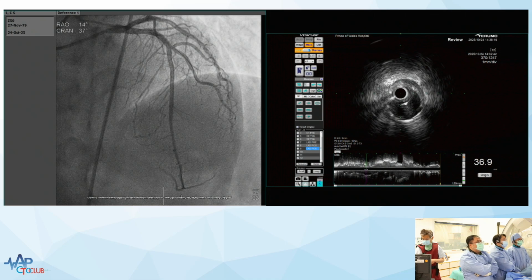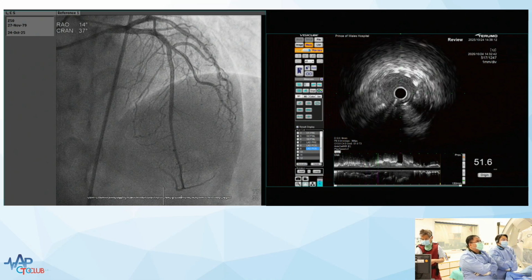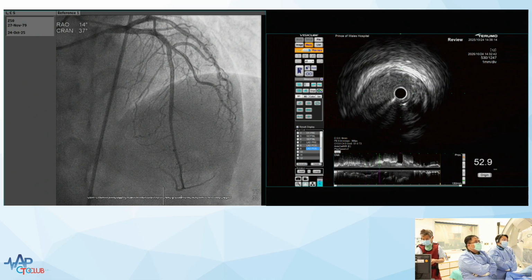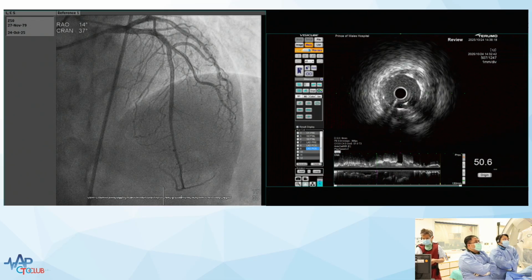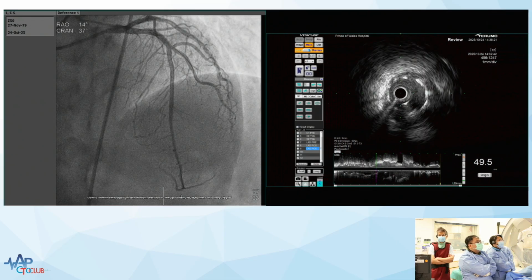You are right, actually, Scott. I'm looking at this more, and the segment is so short. Maybe it's really not worth it because you might dissect, and then we're in trouble. We don't need it. You know what they say? Perfection is the enemy of good. Yep, angiographic result is quite nice. Okay. So Scott, we can finish the case for the publication. Okay, we do not do any more.